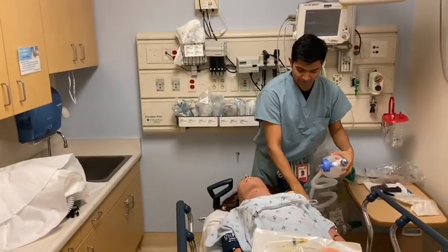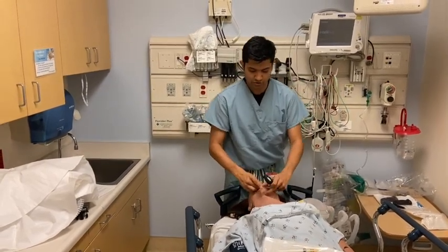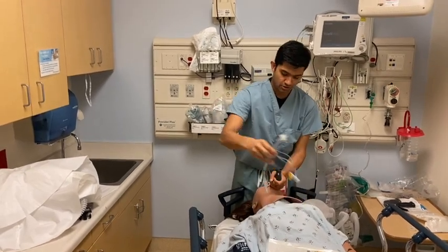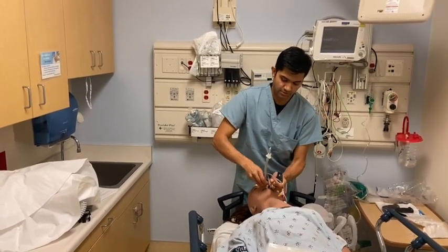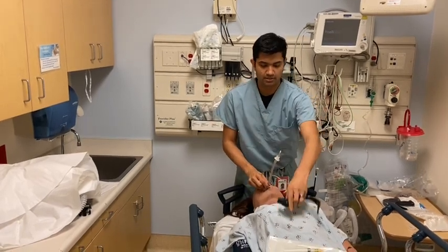Once you have that bag ready, you would go ahead and set your patient up and intubate the patient under video laryngoscopy. Got your tube in. It's obviously always a little bit harder in the mannequin, so I'm going to simulate my tube being in.